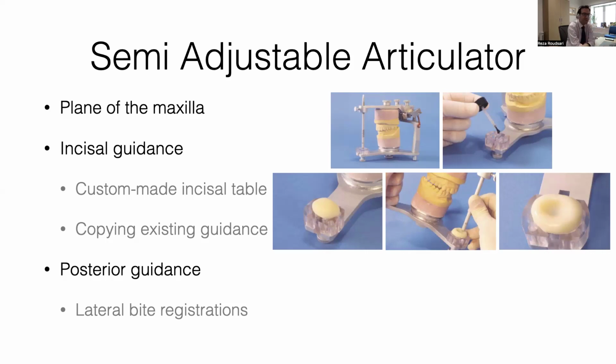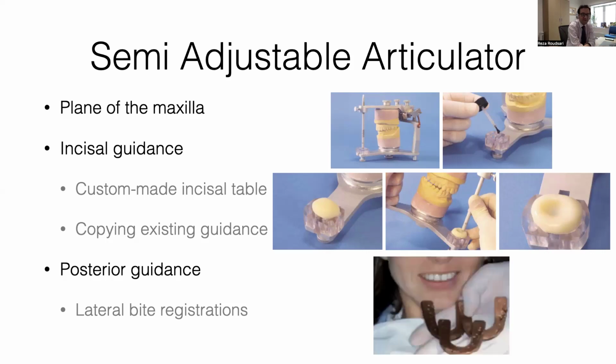It wouldn't be perfect, but with a greater degree. But also you have to transfer your condylar or your posterior guidance. And the way you do that, as well as taking an ICP, intercuspal position, is you also have to use 3 bits of wax. You warm them, put them on the patient's mouth, ask them to gently close, and then grind to one side and stop.